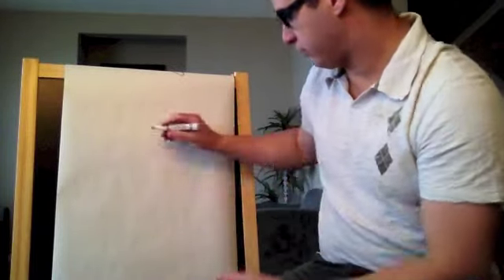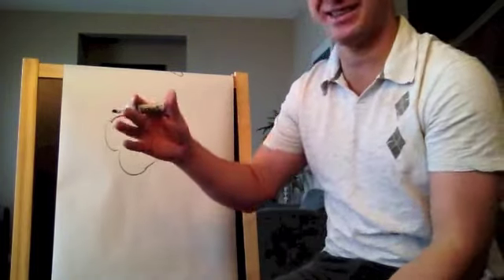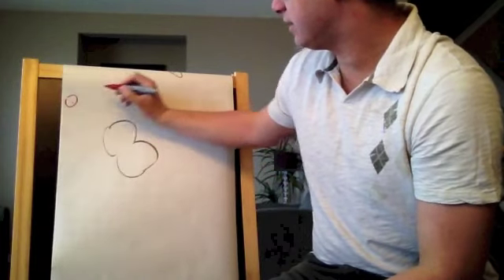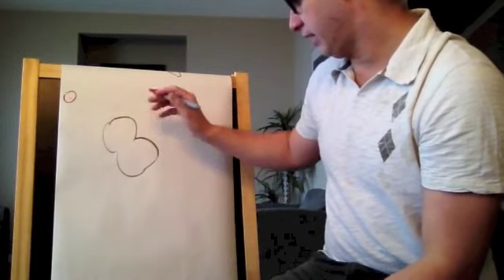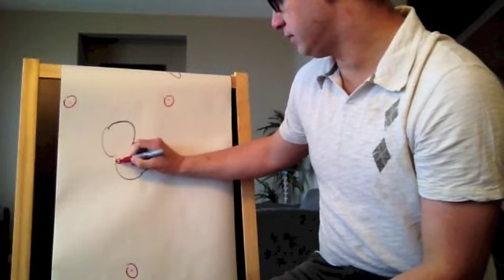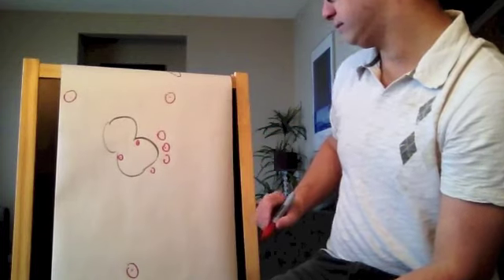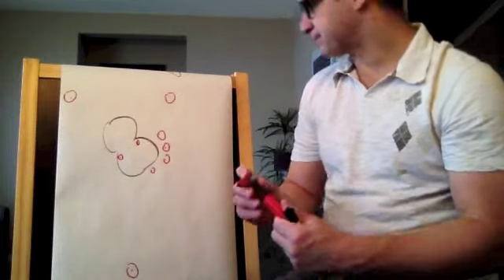Sorry about this. This is a heart. It's the best I can do. So with this in mind, when we put our leads, and obviously I'm doing it a little bit differently, one there, one there, one there, one there, one there, here, and we put those in the legs, but I'll explain that they're pretty much about the same thing.